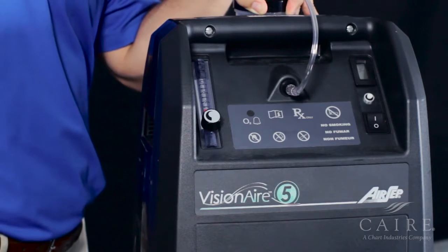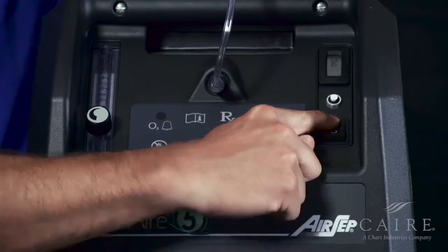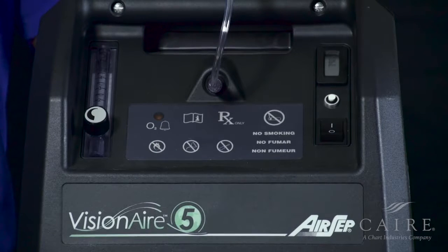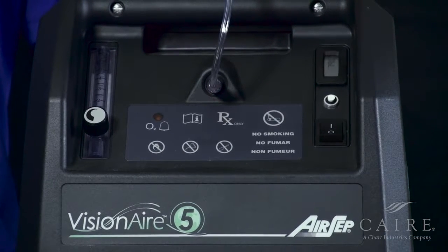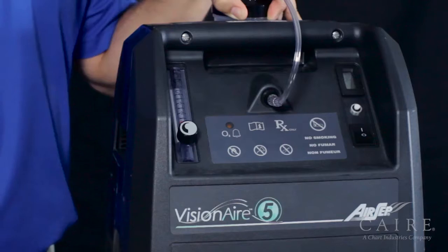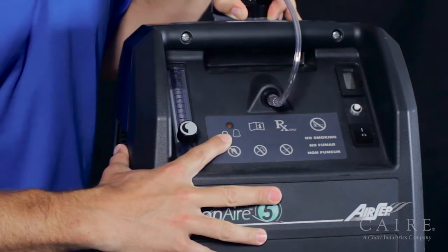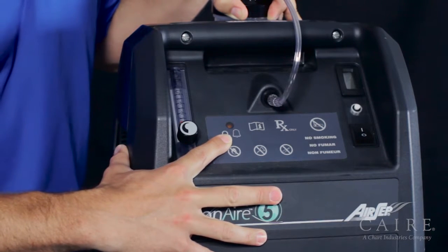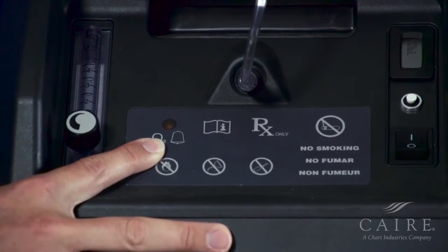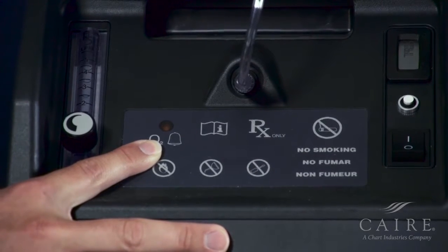Now that we have everything connected, let's go ahead and turn on the unit. Simply press the power button to the on position, like so. The unit's going to first come on and you're going to hear an alarm — that's perfectly normal. Another thing you're going to notice is if you have oxygen monitoring, there's going to be a yellow light that will illuminate. This is perfectly normal and will stay on for the first five minutes.